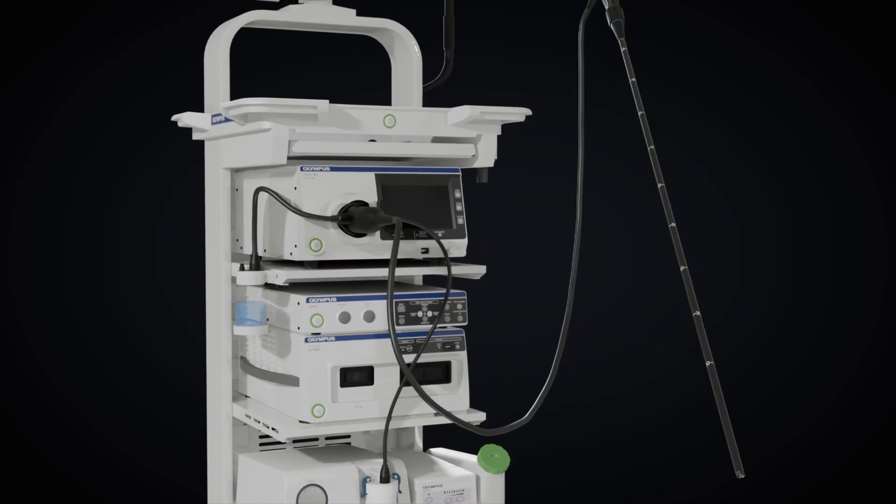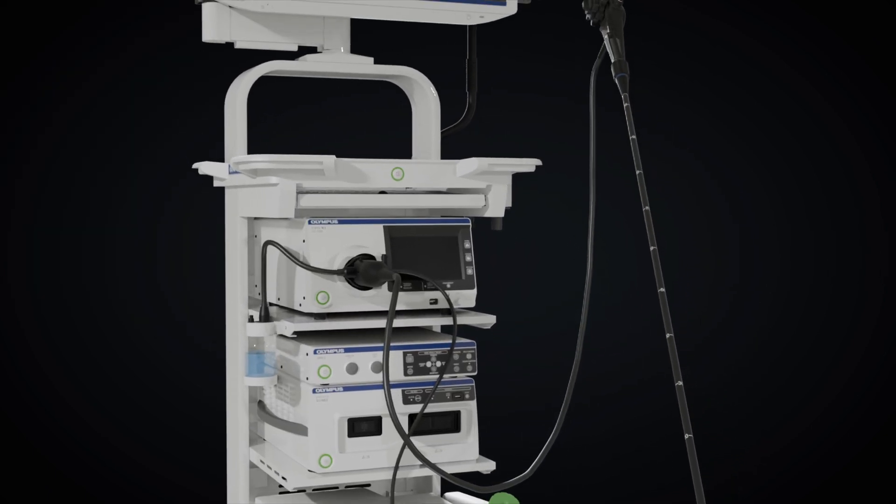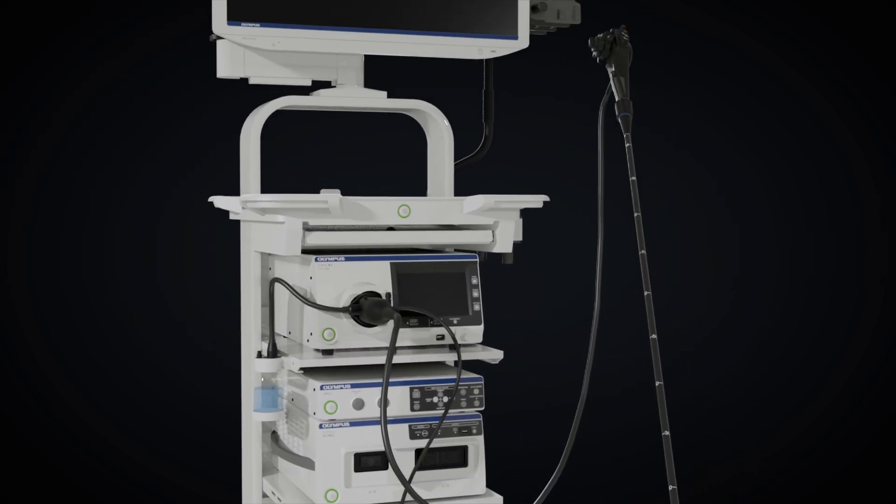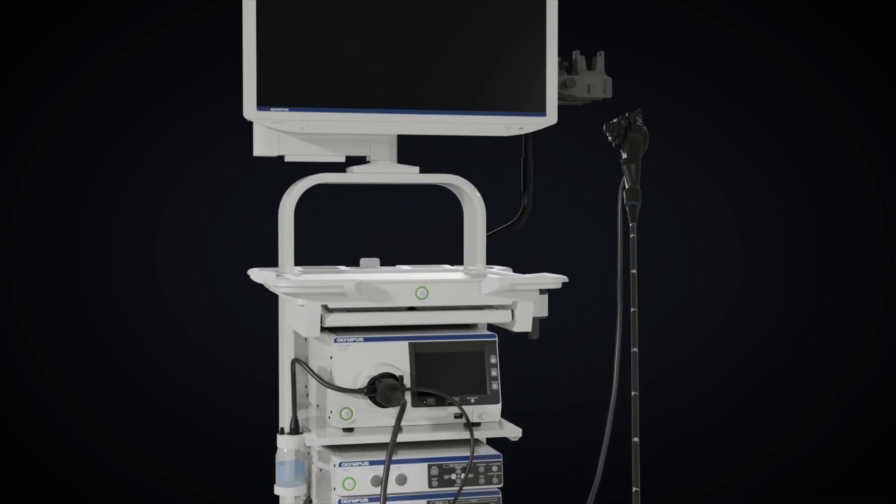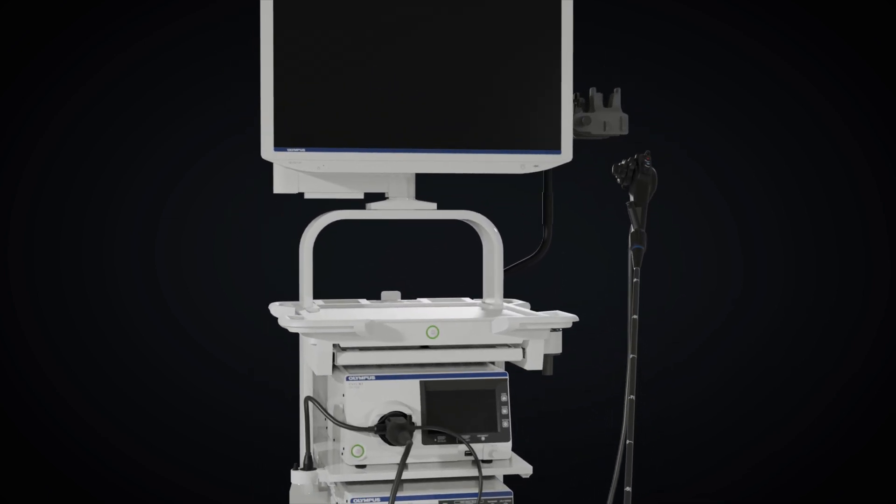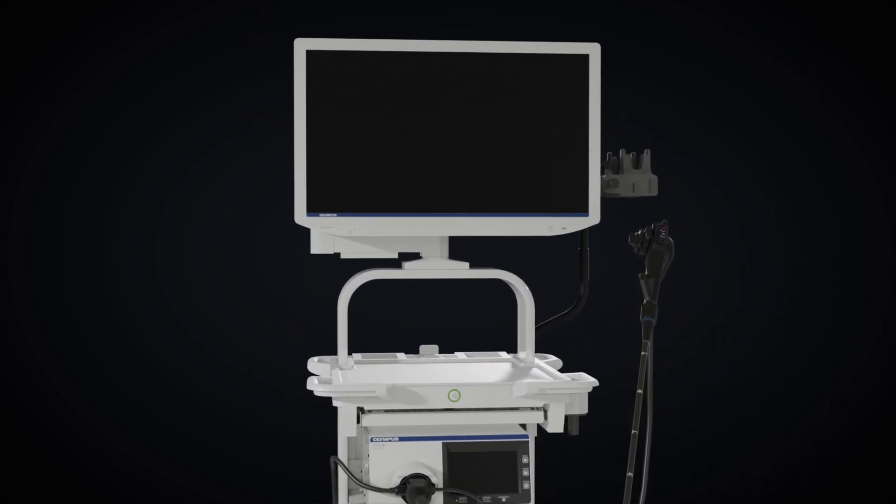The video system center on the main body converts the electrical signals from an image sensor at the tip of the endoscope into video signals and displays them on a monitor.